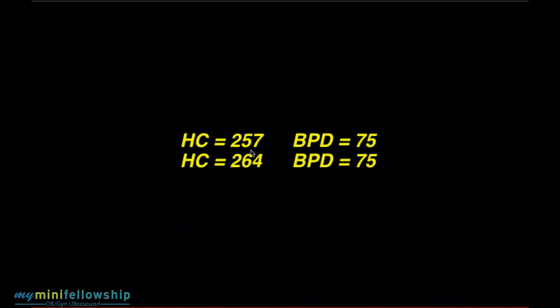So we know the direction of the error and we know the magnitude of the error, and it is unlikely that those 7 millimeters would have a significant impact on our prediction that we're going to make from that measurement. So it's a mistake. It's a mistake we don't want to make. But if we make the mistake, again, as the interpreter, you know the magnitude and direction. Once you know the magnitude and the direction of an error, you are in the driver's seat to make a rational judgment as to whether that measurement needs to be repeated or not.